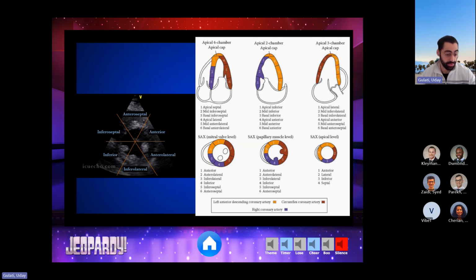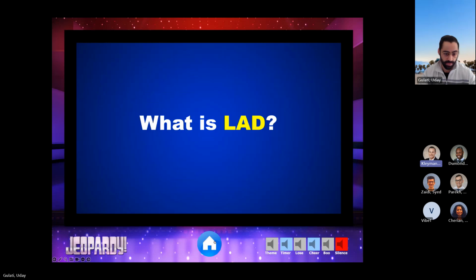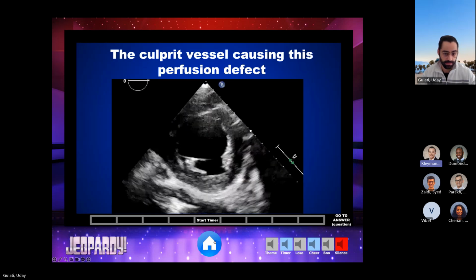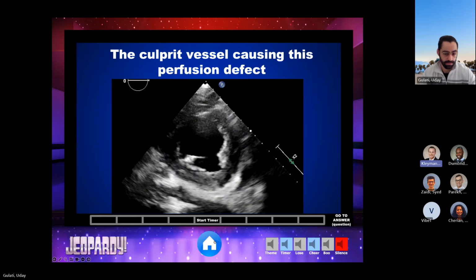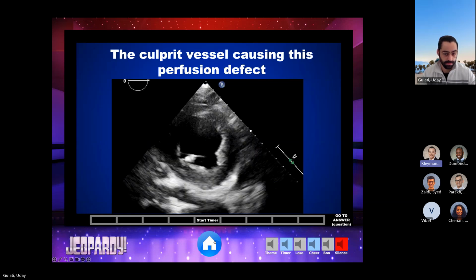And so in this one, where you're really seeing the perfusion defect is in the anterior part of the septum, and so likely it's the anteroseptal and the anterior wall, and you can kind of see the anterior part not perfusing well, so the answer is LAD. The easiest way is just look at where your lower papillary muscle is, and that's your inferior wall. So opposite is anterior, and don't be tricked by the other papillary because it's technically an anteroseptal or anterolateral wall.